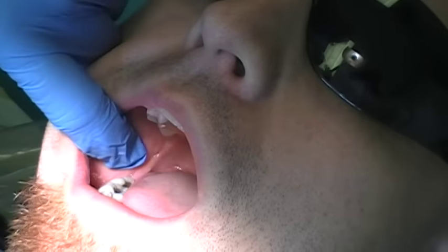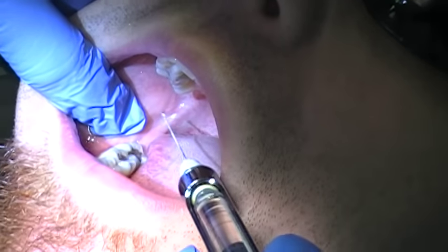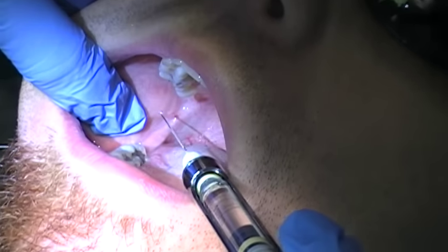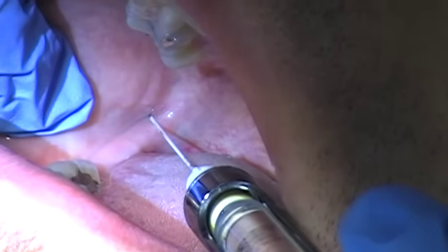Okay, so now we're getting going. I'm going to find the coronoid notch, rest my finger on it. I'm going to bring the barrel over the commissure on the other side — yes, that matches the premolars. I'm going to keep parallel to the occlusal plane, go right next to the raphe, and then push a little bit and come in.